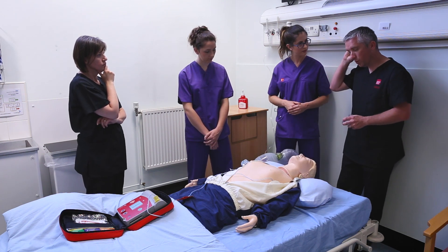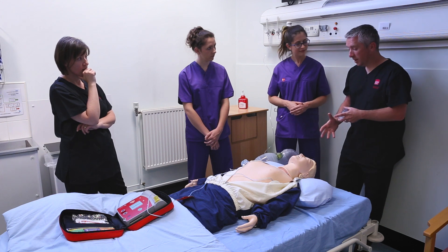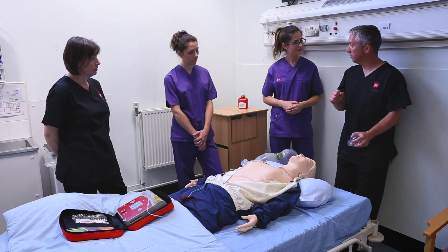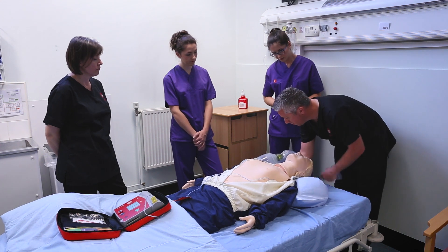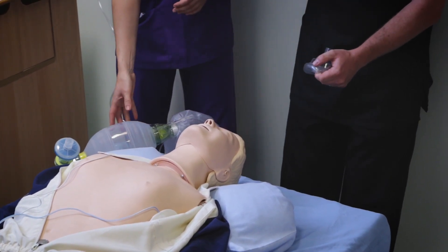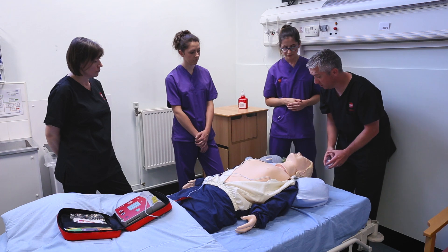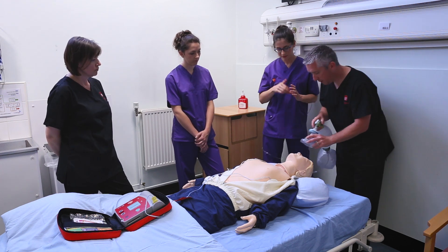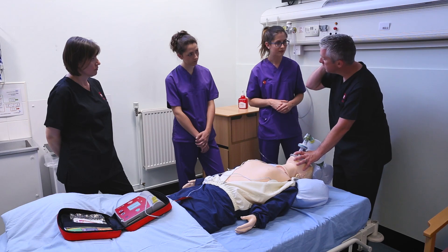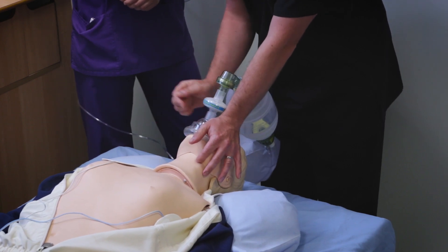Maintaining an airway — one of the most important things is positioning the patient correctly. You can make it difficult for yourself or easy. The easiest way is to keep one pillow under the patient and roll it under the neck so that the head extends with gravity, because the best position to maintain an airway is with the chin forward. Pop the mask over the patient's face. Two fingers at the angle of the jaw right by the ears, because you want to lift that mandible up, both sides. Your hands are more or less vertical and the heel of your hands go on the hard part of the mask.